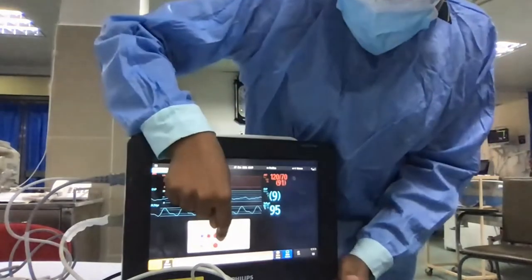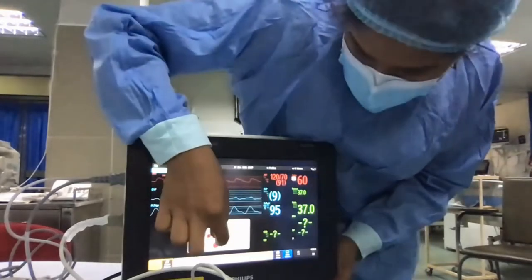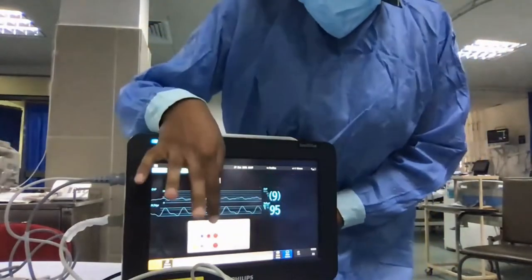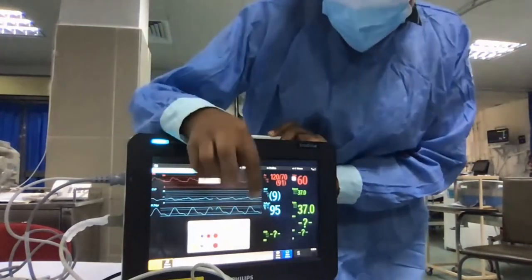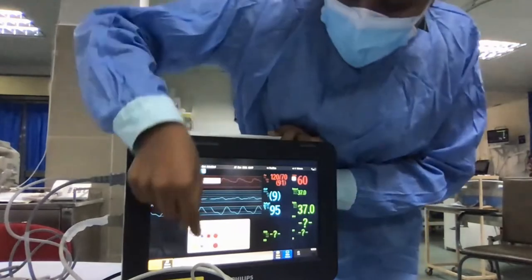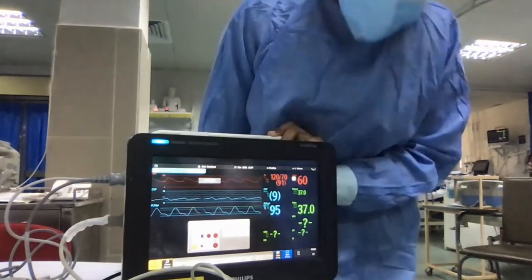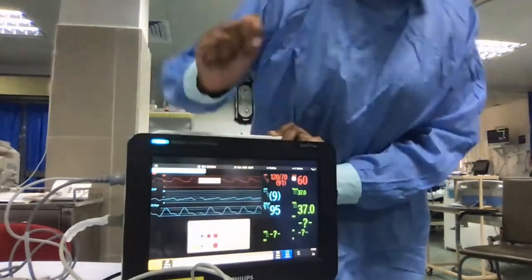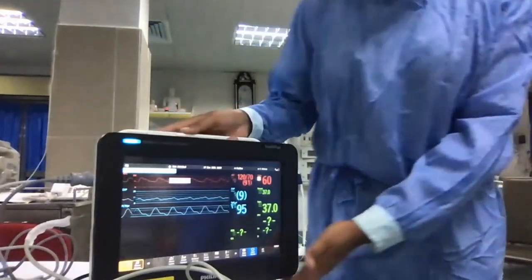Then say earlier somebody else has given a separate label for it. Say they have given AO something. So you need to first change the label to a correct label. In our case, we will be deriving our cardiac output from arterial, ART. So change this label to ART. Just like that, you can change the label. If the port is deactivated, you can activate it like that. Then we'll cancel this. Right. Now we have given the correct command.